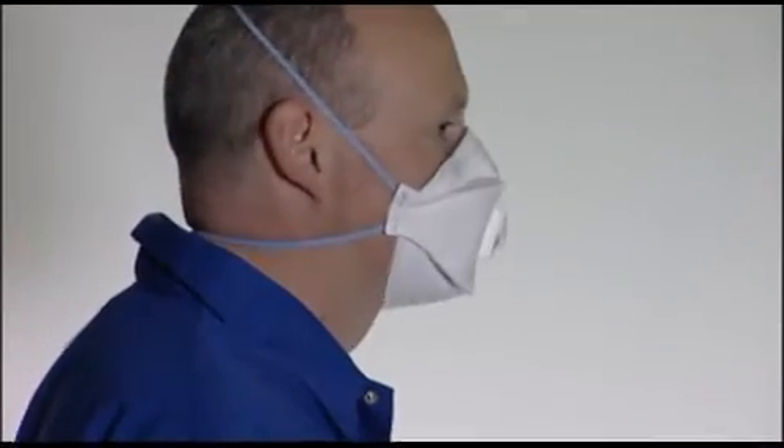This video will demonstrate how to fit the 3M Aura 9300 Plus Series Foldable Respirators.